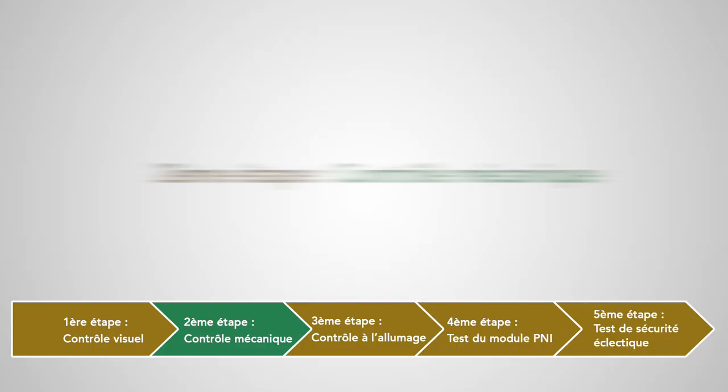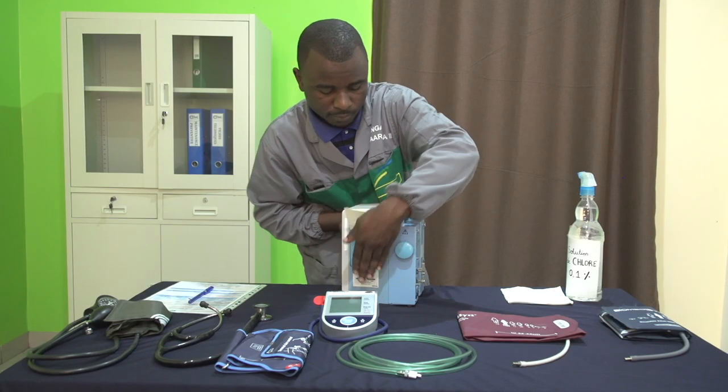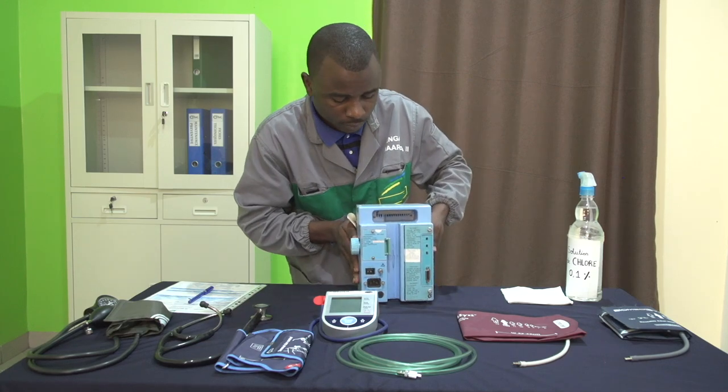On nettoie l'appareil avec un produit détergent désinfectant approprié aux dispositifs médicaux ou avec de l'eau chlorée à 0,1%. Deuxième étape : contrôle mécanique. On vérifie ici l'état du support et l'intégrité du châssis.